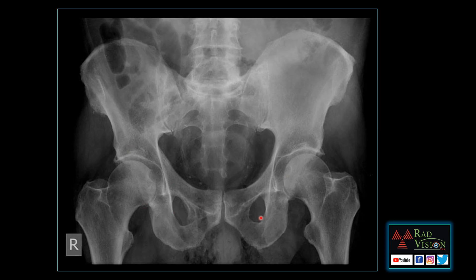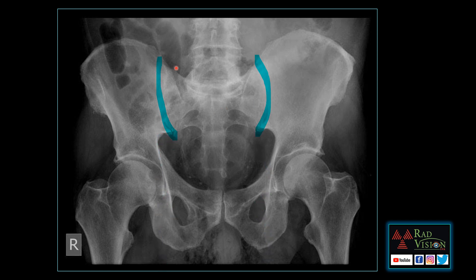Next case: the patient presented with fever and is a diabetic. Here you can see there are faint calcifications in the region of the seminal vesicle. This is the urinary bladder shadow and there are no obvious findings in the bone except some degenerative changes. What are the zones we have to check in the pelvis where we commonly miss findings?